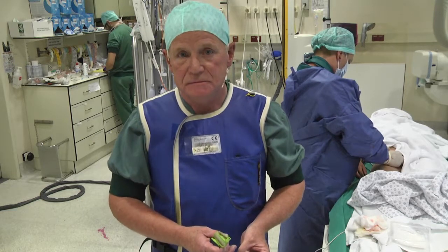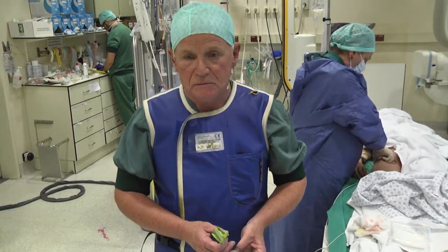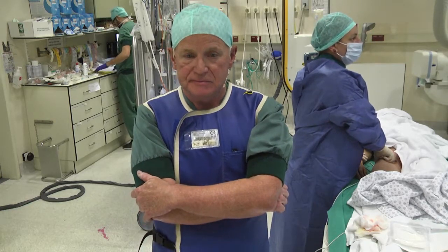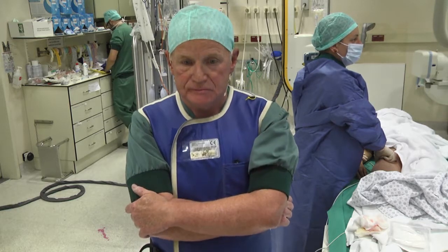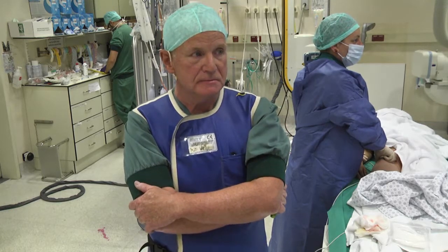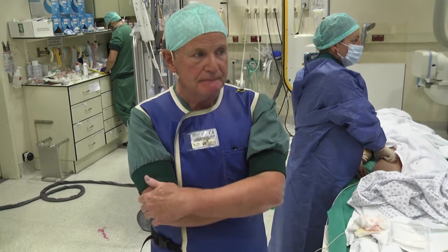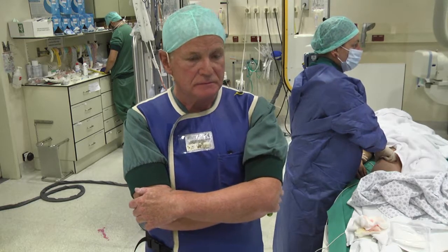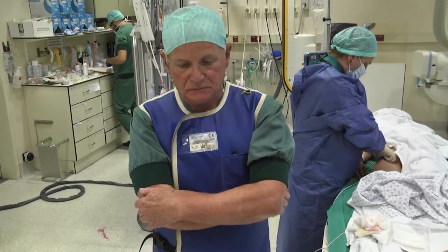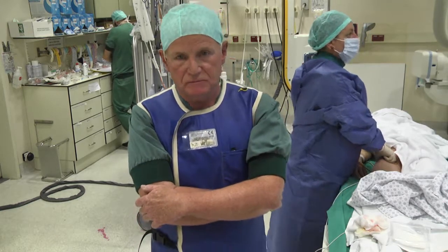Last question. John, that was fantastic. I want to ask Andreas about the balloon expanding the tip of the Ensemble sheath. What size and what high pressure? Because it may actually have an advantage in dilating the tip of it and preventing the migration of the valve. So what balloon and how much pressure do you use to dilate it? Well, this folding is the idea of UNES, and we've done 14 cases now using this folding technique. It helped to take a 10 or 12 millimeter PowerFlex balloon because you get an even dilation of the cover, and it's not so dangerous. So we use a 10 or 12 millimeter PowerFlex balloon for this.